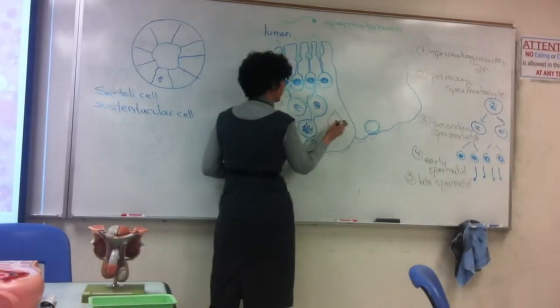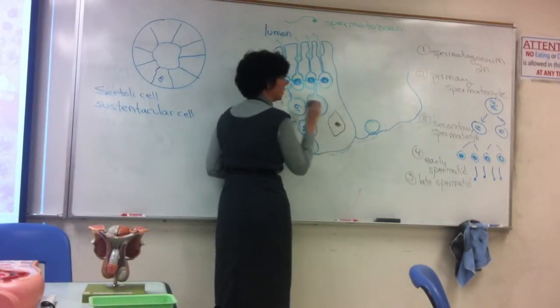The nucleus is more angular and has a very prominent nucleolus.